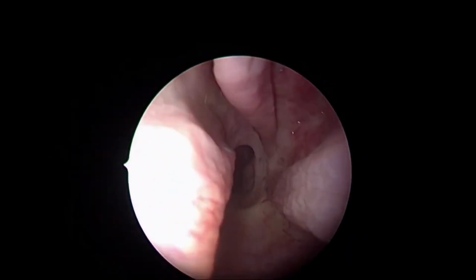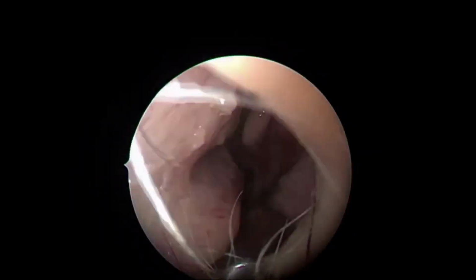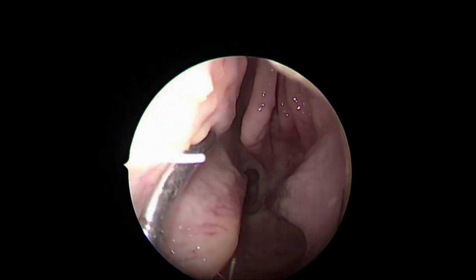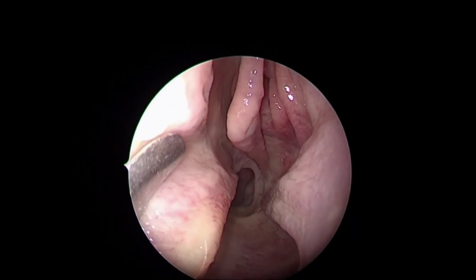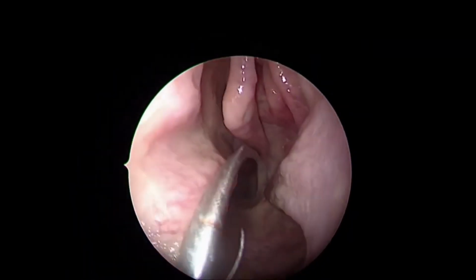So this is the left nasal cavity. Can you see this? Yeah, very clearly. Okay, so this side is the nasal septum. As I mentioned, we'll dissect this later with the flap, the Hadad flap later.